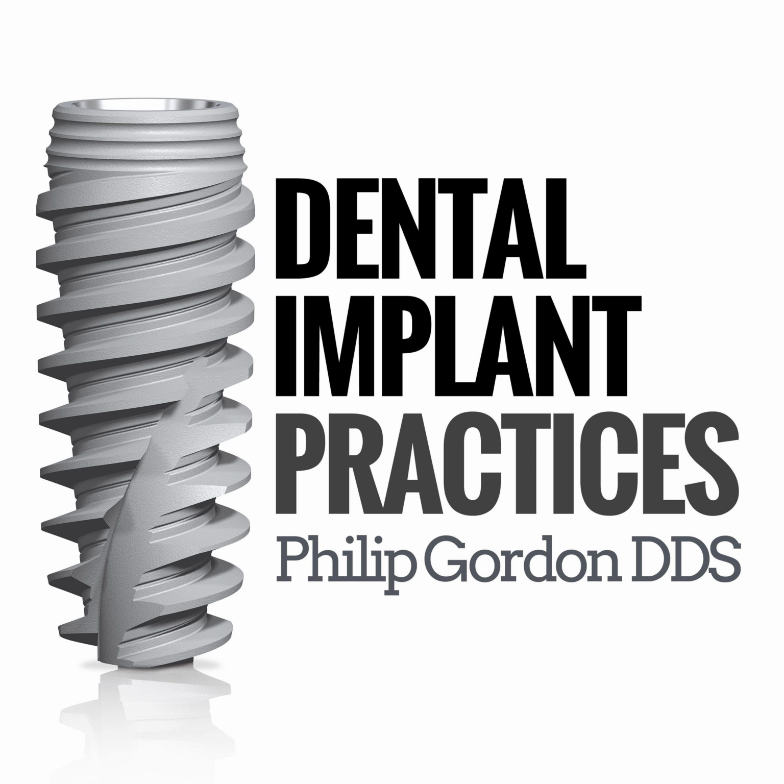Okay, now the reason we're doing this is that this is getting all the records we need to go to final. Our abutment level impression, our VJIC, our bite block, sometimes our tooth selection. So while the patient's healing for however long you decide, 3 to 6, 7 months, however, you send that clear bridge back to us while they're healing, we can already fabricate the wax try-in. So by the time they come in for their healing appointment, you already have the wax try-in.